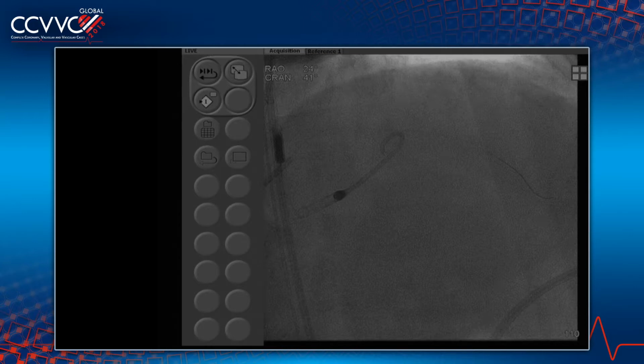That was sort of my point. This looked to me like a circ lesion you do quickly, and if you want to do the right as a CTO, you probably bring them back for that. Do it all radially. Yeah, and I think honestly, before the live case, we reviewed every one of these films. This looked worse. 0.8. Good.